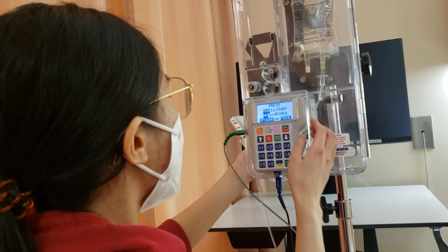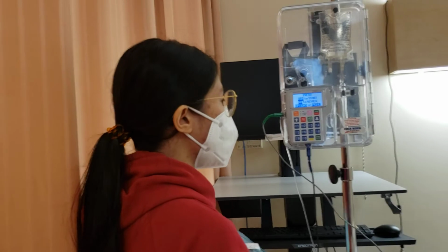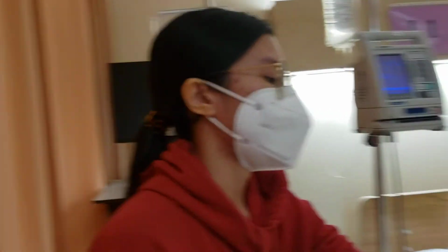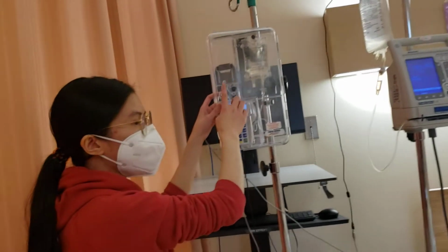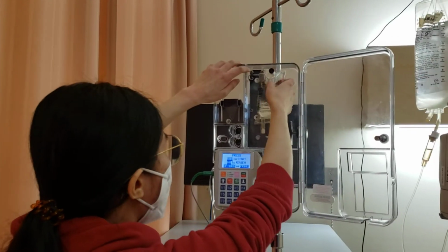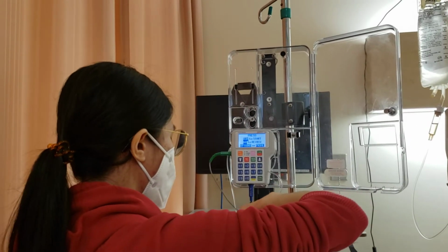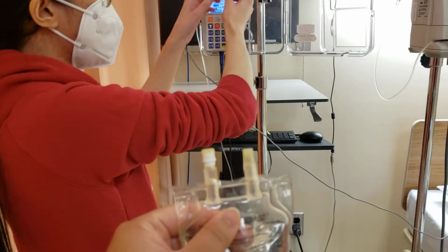So I will just get my second nurse to check or review the PCA with me, and once I get the confirmation that it's all right, I could hook my bag. And also make sure that you got the key to open the PCA. I will just let my second nurse hold this previous bag.